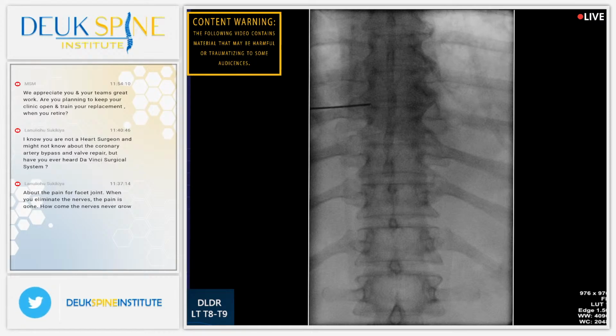All right, let's see if we can get this. We might be there. Maybe your anesthesia magic helped us.